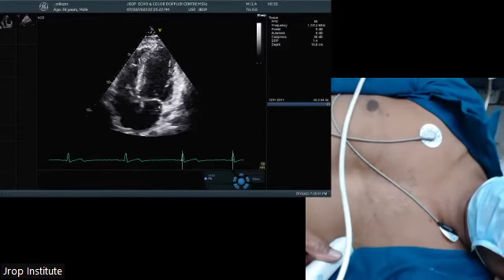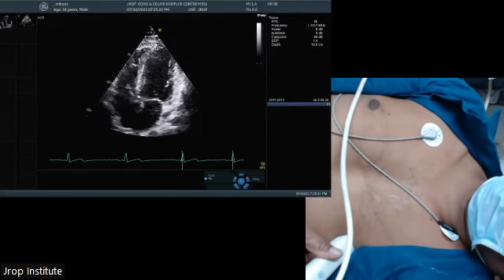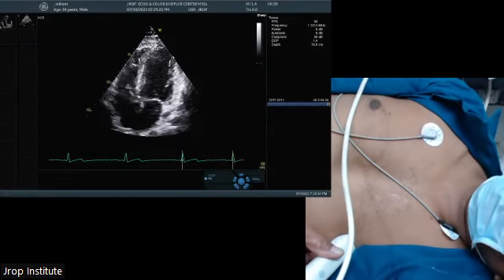Now, the mitral valve is located in the basal segments, right? Papillary muscle is in the mid segments, and the apex does not have anything. That is the apical segments. So if I go to the parasternal short axis view and happen to see the mitral valve, these are basal segments. I did not touch them deliberately at this moment. So these are the septum, and these are the 6 segments of the basal segments of the LV.